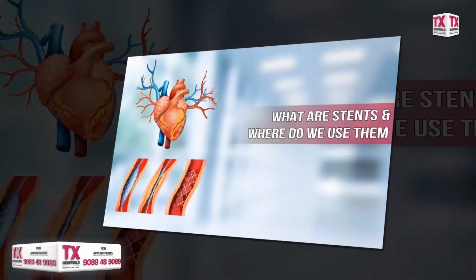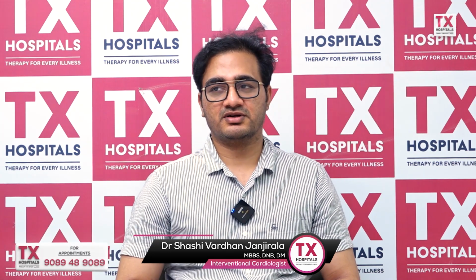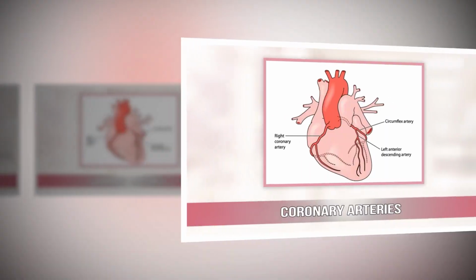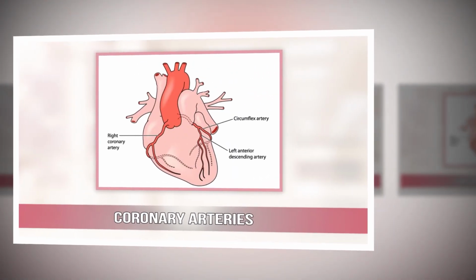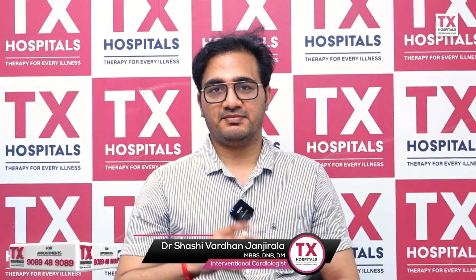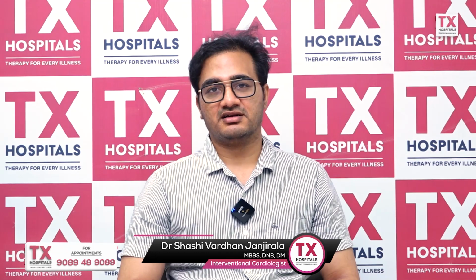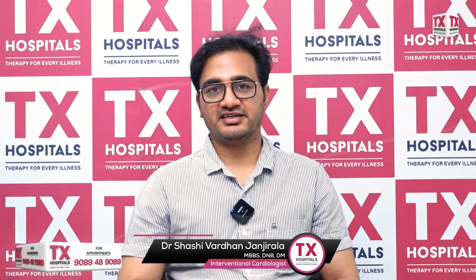Today we are going to discuss what stents are and where we predominantly use them. As we talk about stents, you might have heard of them mostly in the coronaries. Coronaries are the arteries which take blood to the heart. We usually have three major vessels in the heart and multiple small branches from them. The three major vessels are the left anterior descending artery (LAD), the LCX and the RCA.